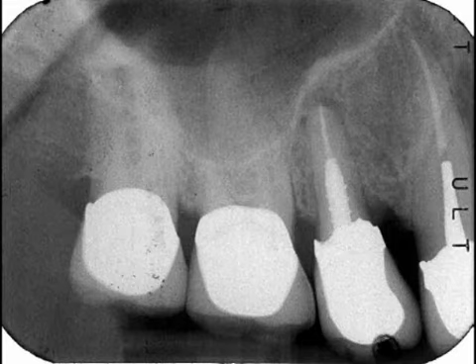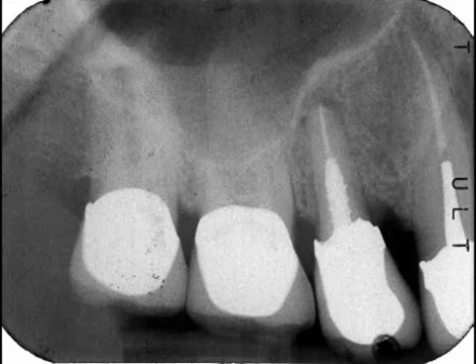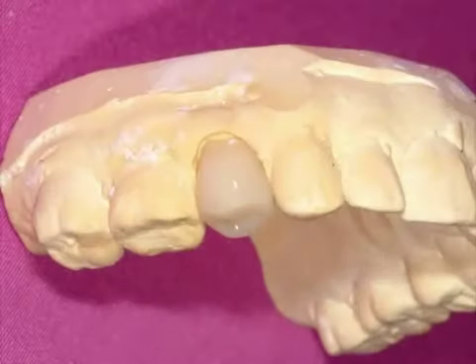if possible, that the implant be placed at the time of extraction, and that, if we could, also place a provisional restoration. Her dentist was happy to go along with this request, and so not only did he send her over with this radiograph and a referral slip, but also sent her over with a provisional crown that he'd made on her study model for us to place at surgery.